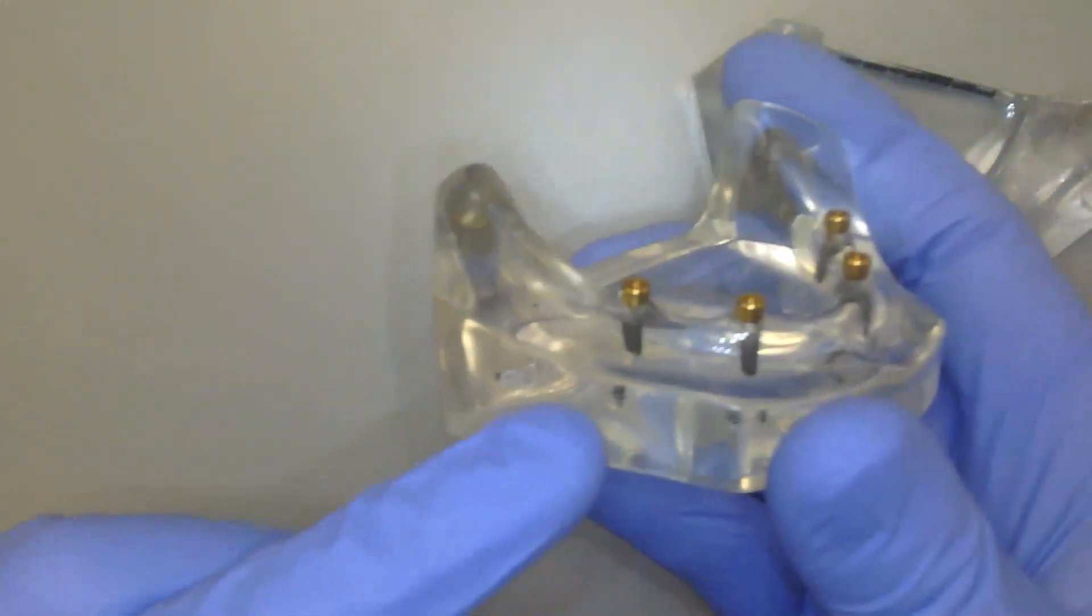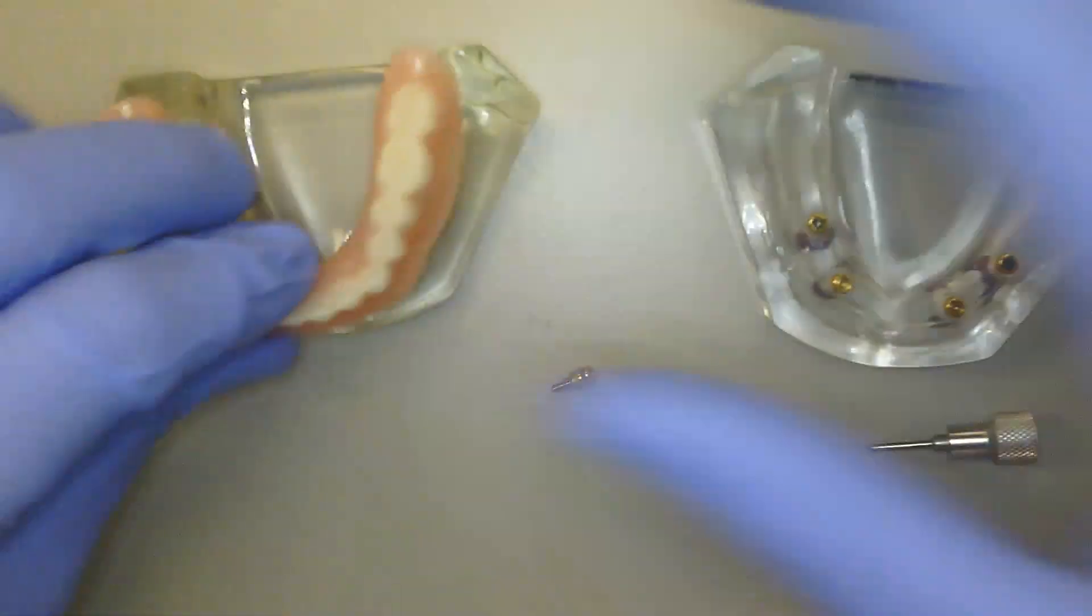But doctor, you told me I don't have bone for implants back here, so do you have another option? We do. Your option is locator angled.